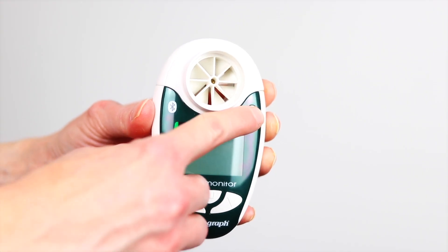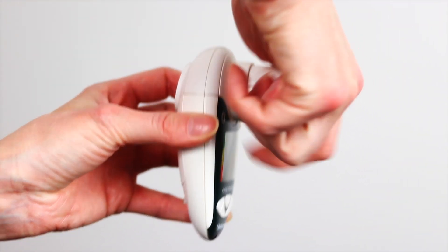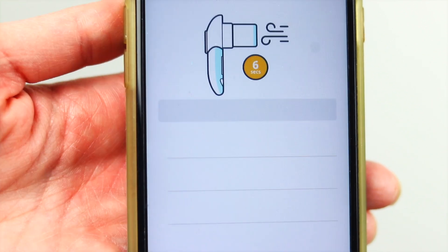I'm going to show you how to record a blow on your Vitalograph Bluetooth lung monitor 4000 in your Breathe app. Firstly, turn on your spirometer by pressing the circular button on the top right and insert your mouthpiece. Open the Breathe app and tap Add on the lung function, and then the app will connect to your spirometer and show the ready-to-capture screen.